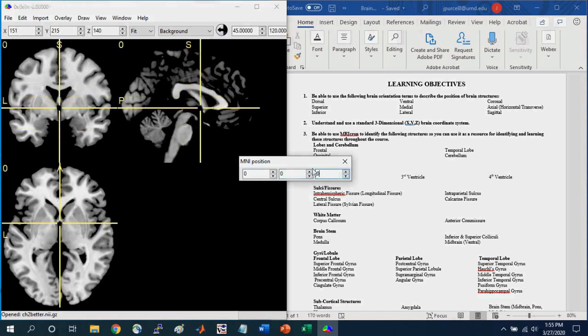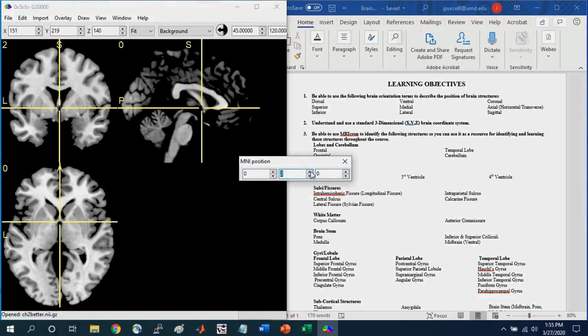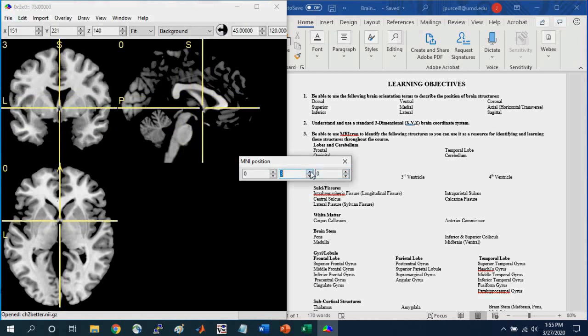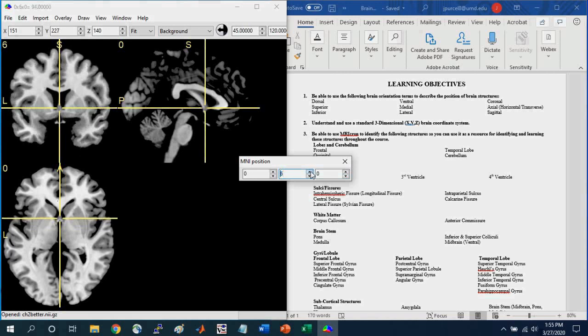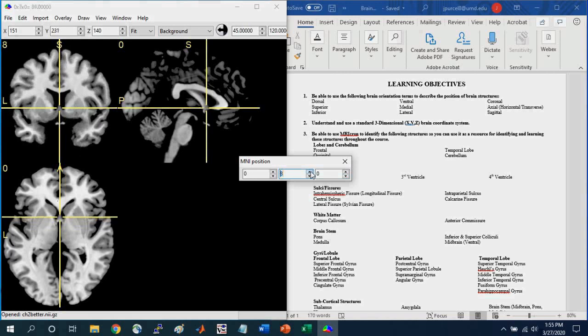So one important aspect of this coordinate system is that it is in millimeter increments. So every increment anteriorly here that I'm going in the Y dimension is in millimeter increments, okay?